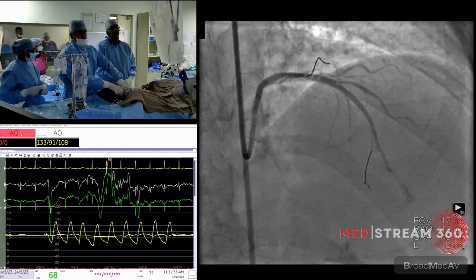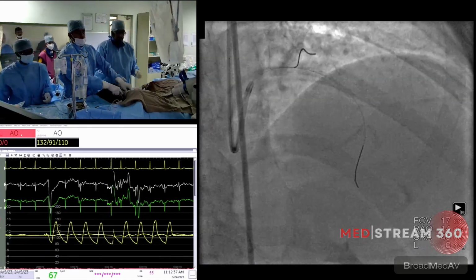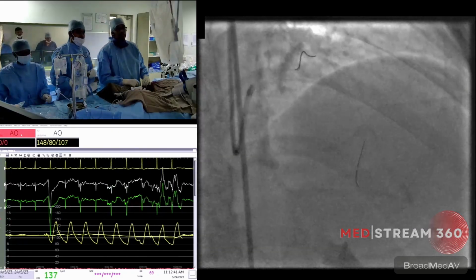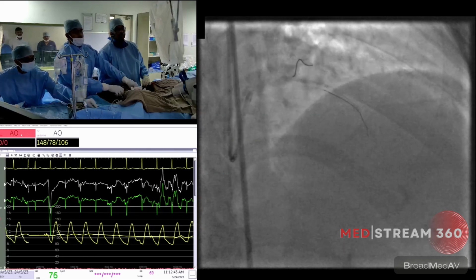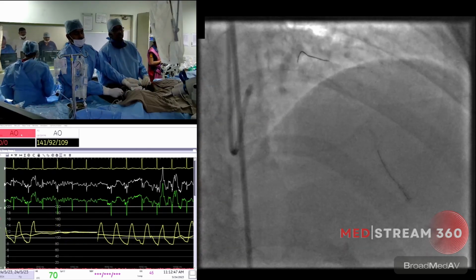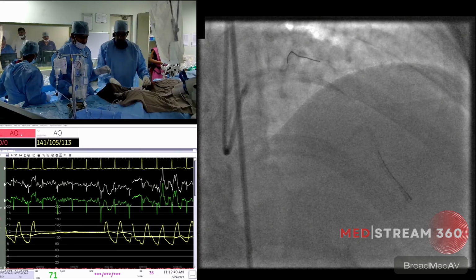I think the LAD is okay. The diagonal is flowing well. There is some pinching, but I'm not going to chase that. What do you think, Nanda? Yeah, we have to take an OCT. Yeah, and we'll take an OCT and I'm happy with the diagonal flow. Okay, take the OCT down, please.